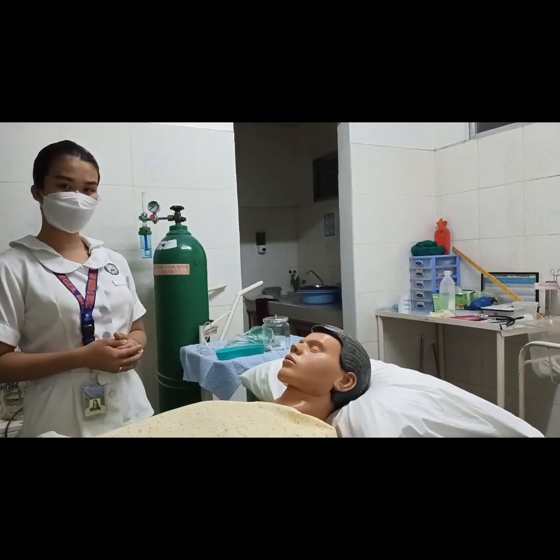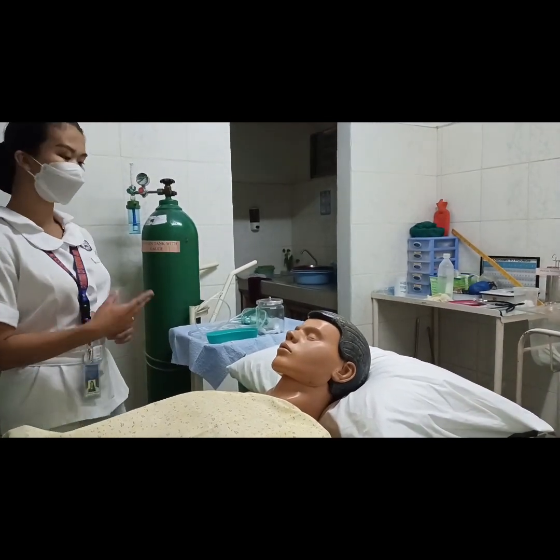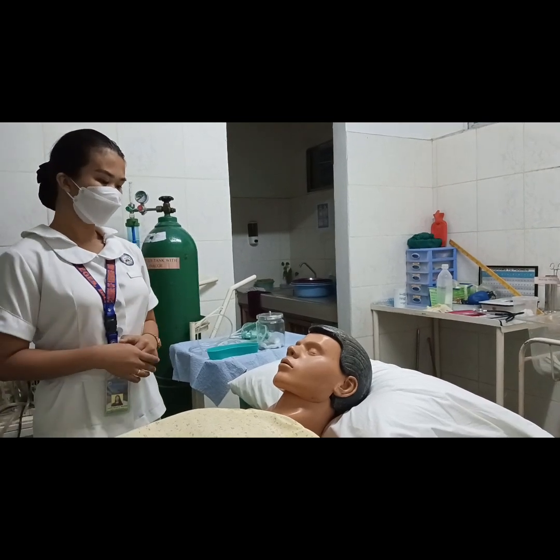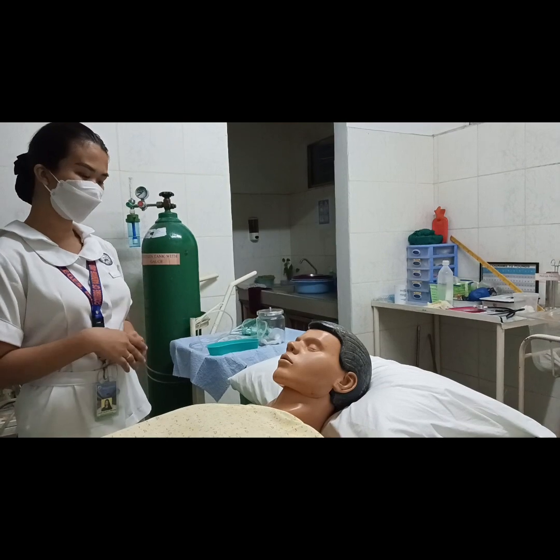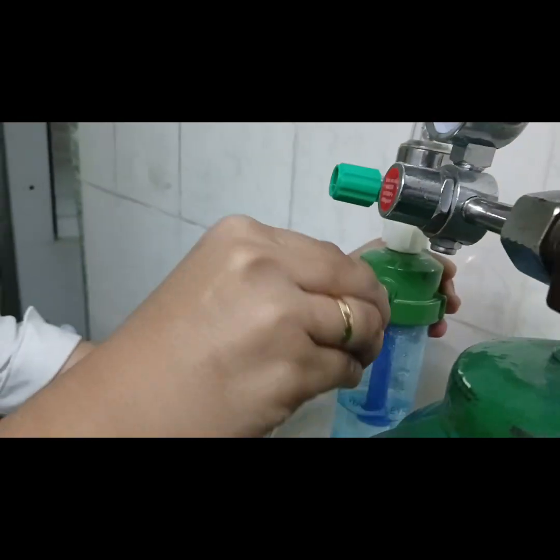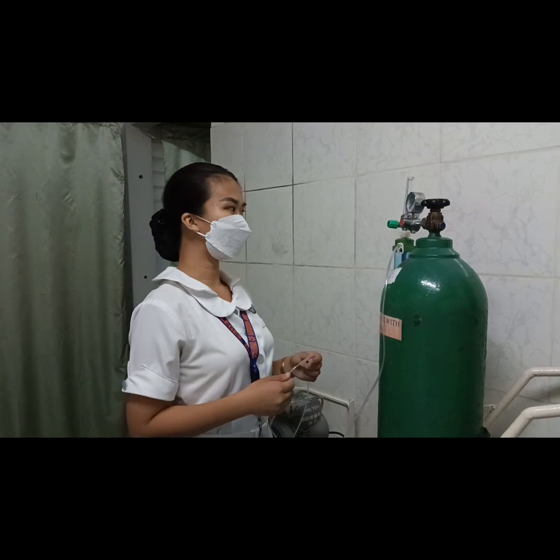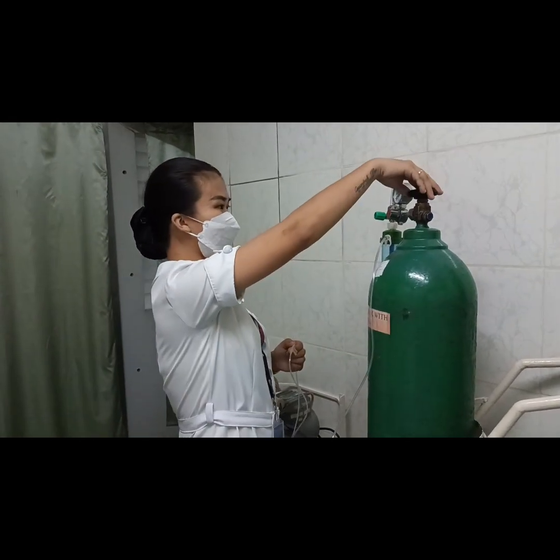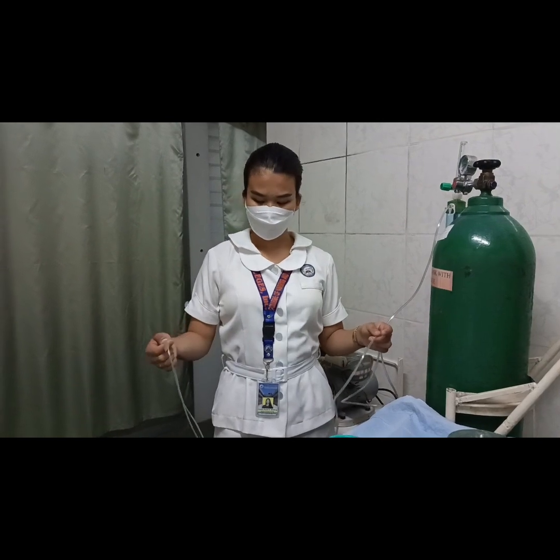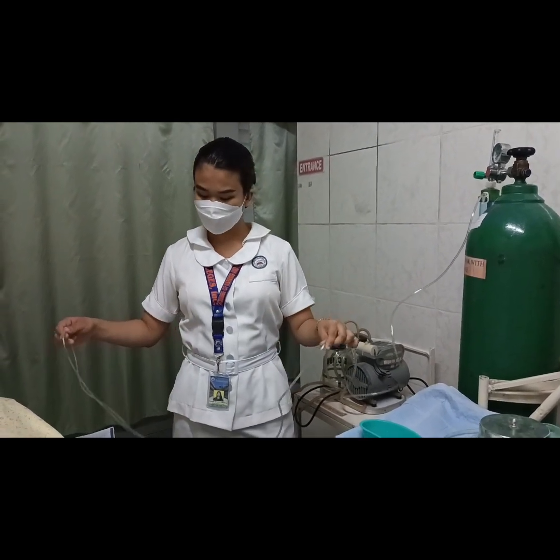I will place the patient in semi-Fowler position. Next, I will attach the nasal cannula to the oxygen source to deliver moisturized oxygen and to prevent dryness of the nasal mucous membrane. I will turn on the oxygen flow rate until bubbling, and I will check if the oxygen flow is adequate and if the connections are intact.